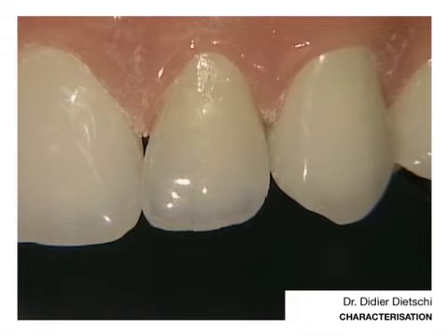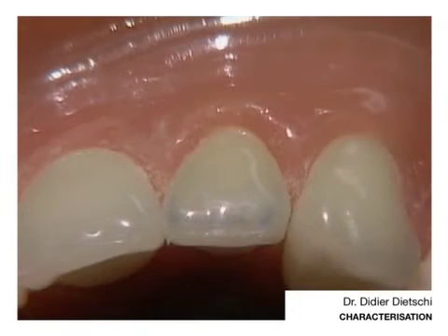If you exaggerate and do that on every single case, you might end up with a restoration which doesn't fit with the neighboring teeth. So all this needs to be realized according to the color characteristics of neighboring teeth.